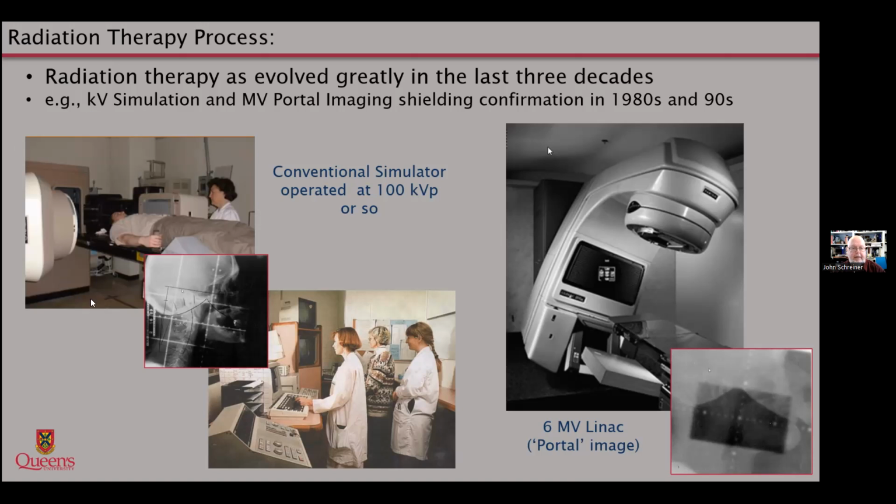It simulated the motion that a treatment machine could come by, and it was used to identify the radiation beams that you would want to bring in. And in most high-income countries, we don't use this anymore, but in much of the world, this might still be the way the treatment planning is done. And then eventually they will be treated on the machine at the higher energy.